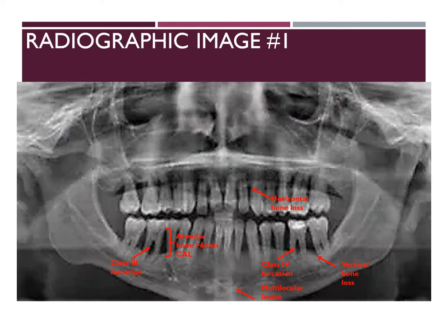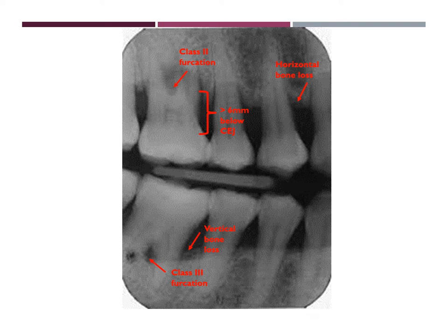In this radiographic image, you can clearly see horizontal bone loss on the anterior maxillary and mandibular arch. Vertical bone loss is present in the maxillary and mandibular arch as well, however it is more localized to the posteriors. You can clearly see a class 4 furcation which is clinically visible in another image, as well as a class 3 furcation on tooth number 30. On that same tooth, you can also see a 6 mm clinical attachment loss. There is also a multilocular lesion between teeth number 23 and 26. An additional close-up radiographic image was added to better show the bone loss, furcation, and clinical attachment loss.